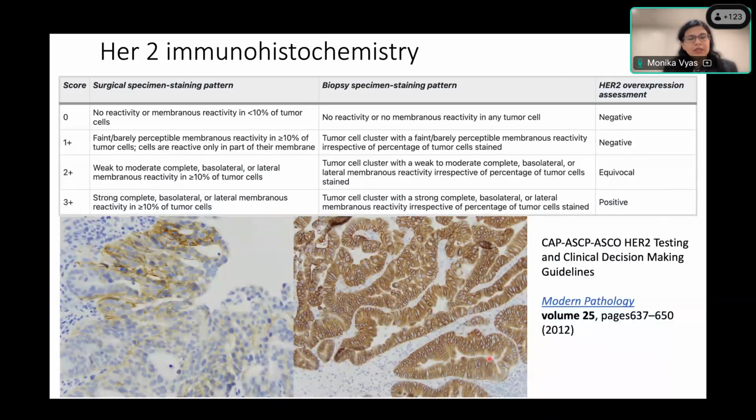And then HER2 IHC, it's really a little troublesome to interpret, and you have to know your stain, how it works, how your control worked that day. So the criteria are slightly different for surgical resection specimens and biopsy specimens. Depending on the amount of tumor, which shows either weak to moderate or complete staining, you would score the HER2 IHC as 1+, 2+, or 3+.